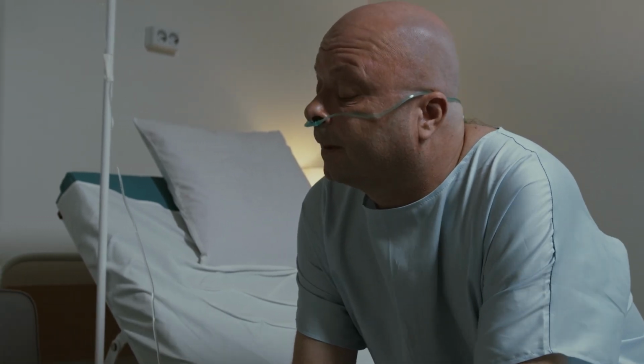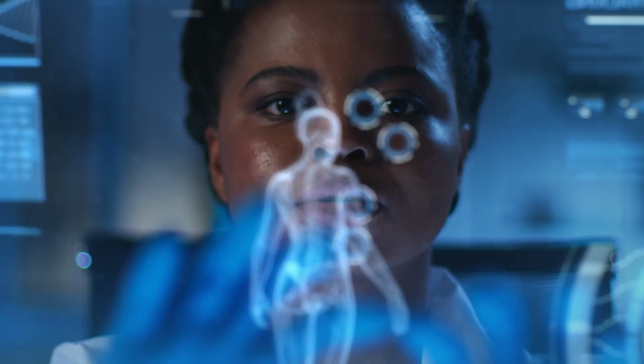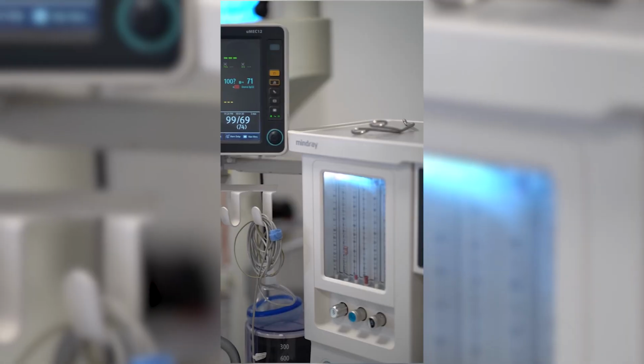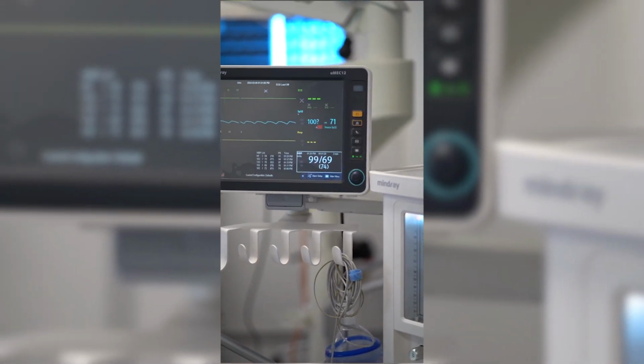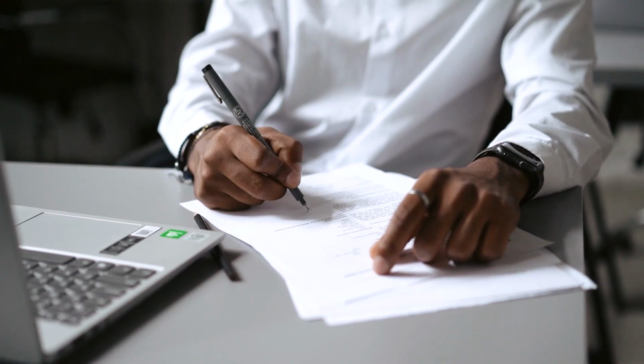Now, one might ask, are there legal consequences for Contec Medical Systems due to its backdoor? In regards to regulatory action, the FDA, which authorizes medical devices for use in the US, may take enforcement action against Contec for violating medical device safety and cybersecurity regulations. Civil suits may also take effect. Healthcare organizations and patients affected by the backdoor may file lawsuits against Contec for damages related to privacy breaches and potential patient safety risks.